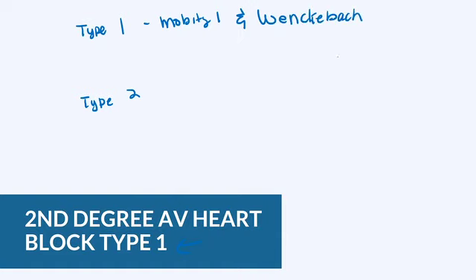These are actually named after the people that discovered them, and they're here to make our life hard. But we're going to keep it simple so that at the end of these two lessons, you're going to be able to understand the difference between these two, so that when you see that on an EKG, you're able to differentiate and identify them.